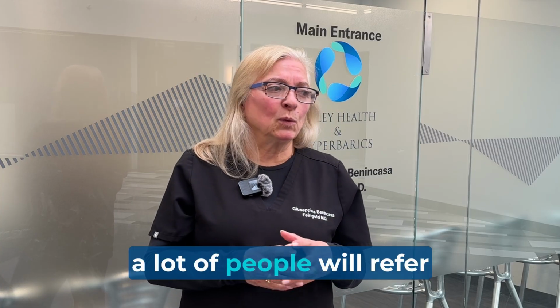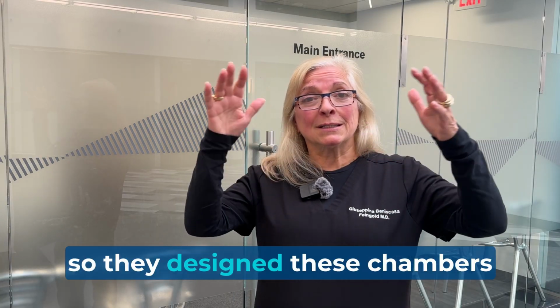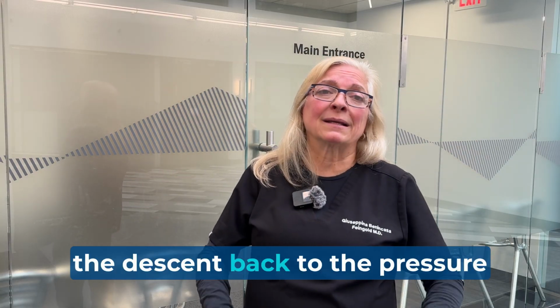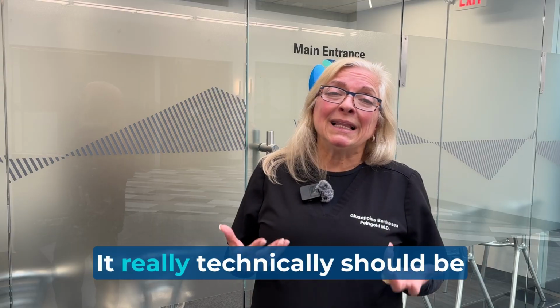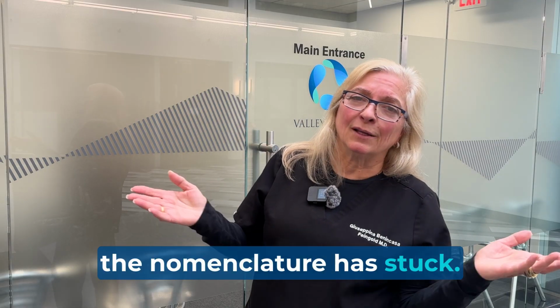First of all, a lot of people will refer to them as dives. That's because historically these machines were designed to treat the bends. We really couldn't put patients back in the water, so they designed these chambers to put somebody in and simulate the descent back to the pressure where they were, and then bring them back up slowly. It really technically should be called a treatment, not a dive, because you're not in water, but the nomenclature has stuck.